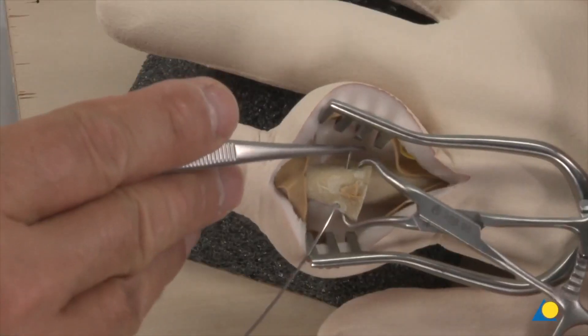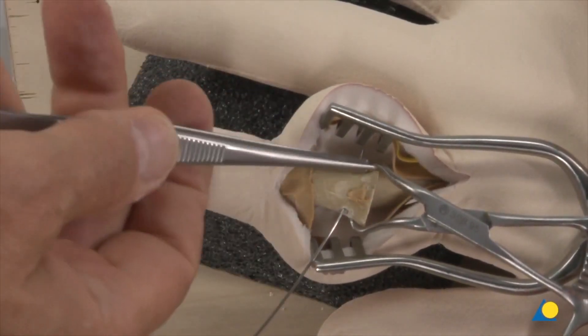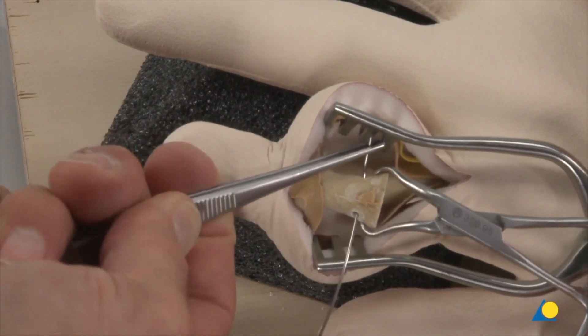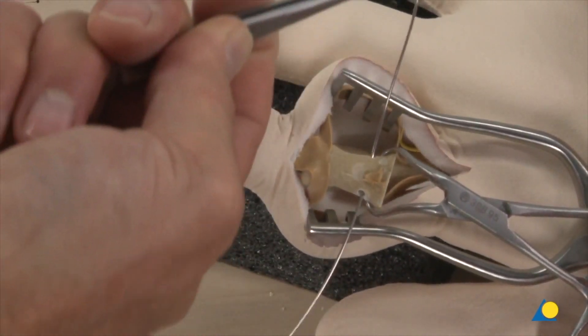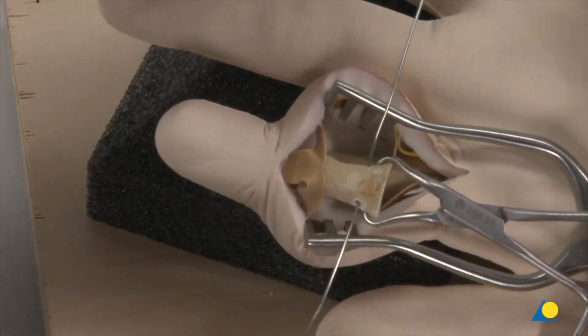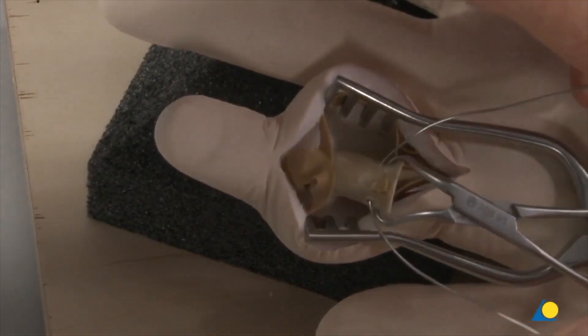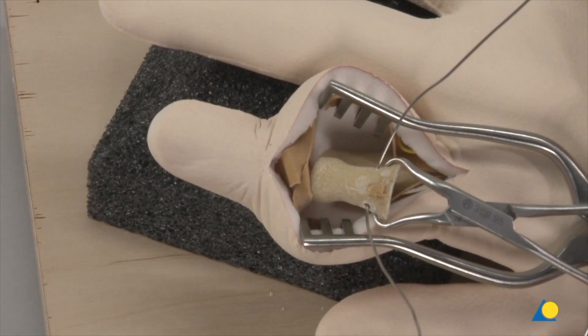The circlage wire is straightened to facilitate advancement through the drill hole and is then inserted. On the opposite side, the circlage wire is taken underneath the extensor apparatus, taking care not to injure the digital nerve and artery.